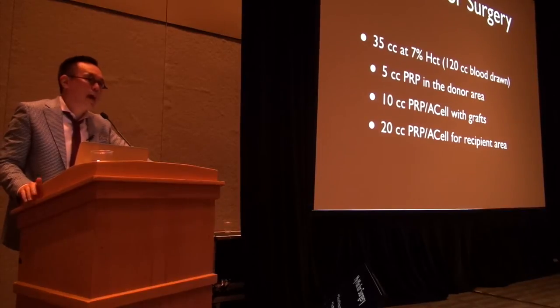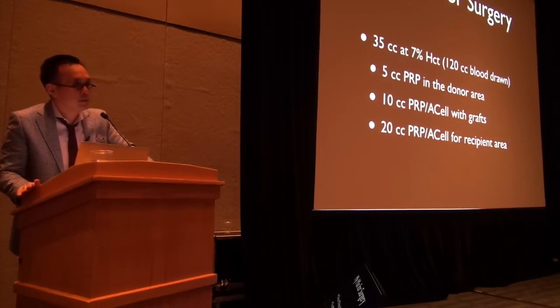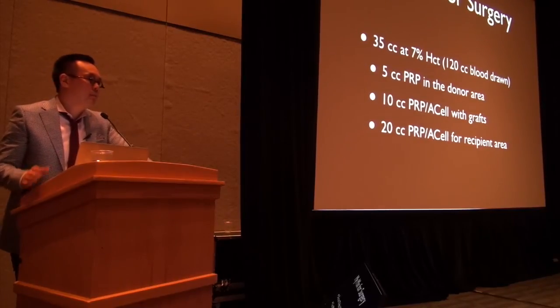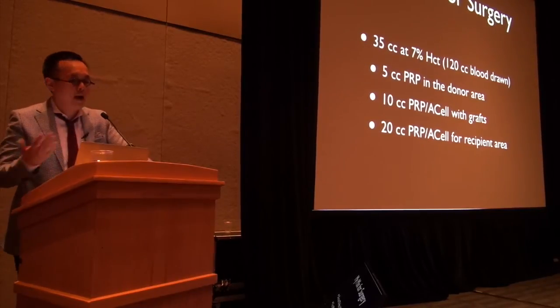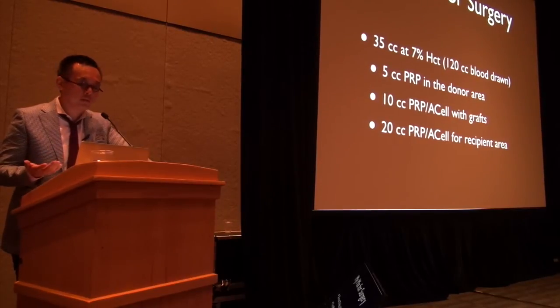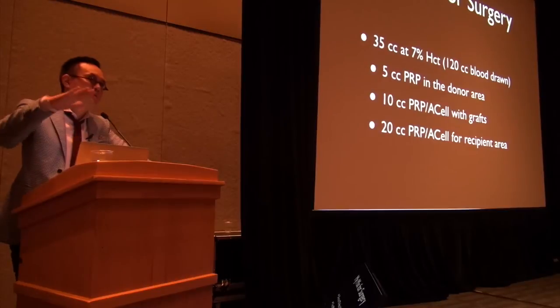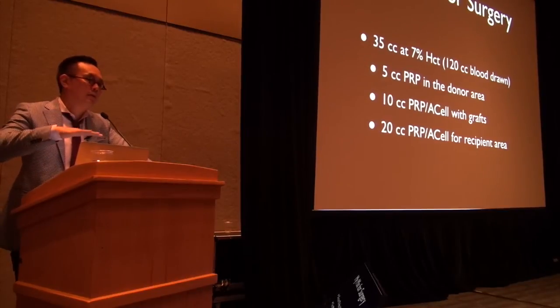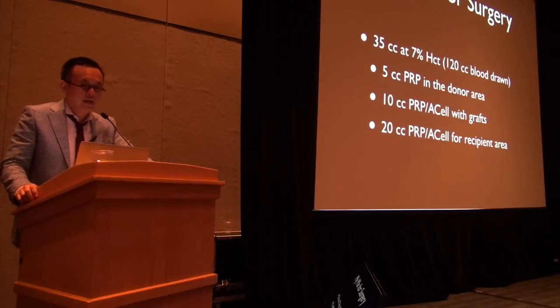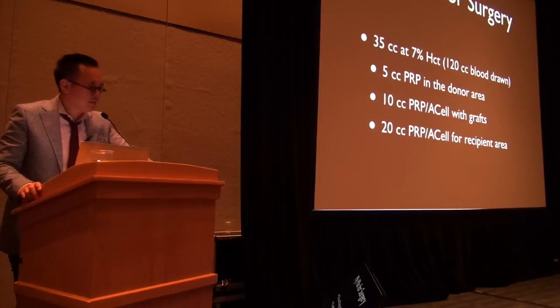People ask me, do I do it after the recipient sites, before the recipient sites, what plane do I do it in? I just put it in subcutaneously. I've done it both before I make recipient sites and after recipient sites. I've seen equal results. I now do it after recipient sites so I can get all the recipient tumescent out, and then I put it in at the end. But I honestly don't think it matters, so long as you get it in there. It's the subcutaneous plane. I just like to do it at the very end.